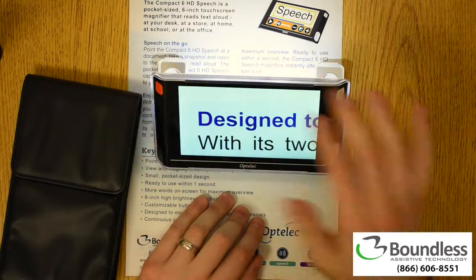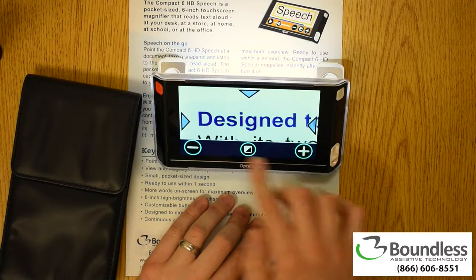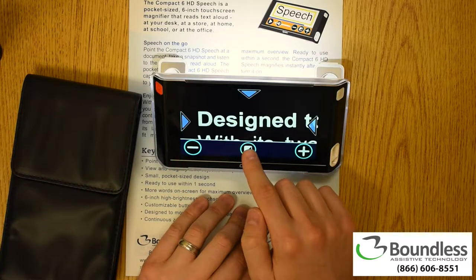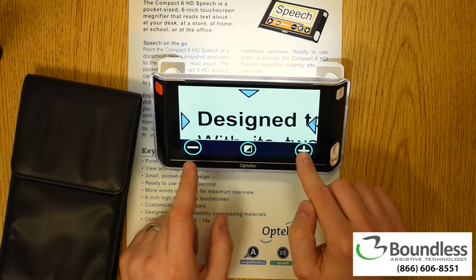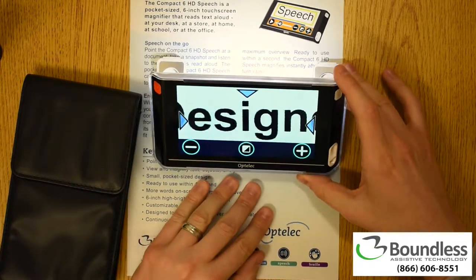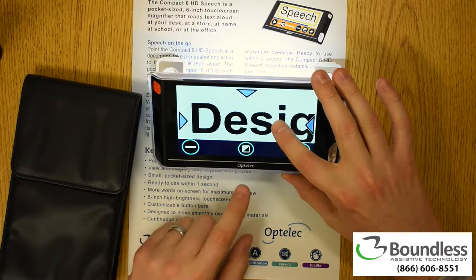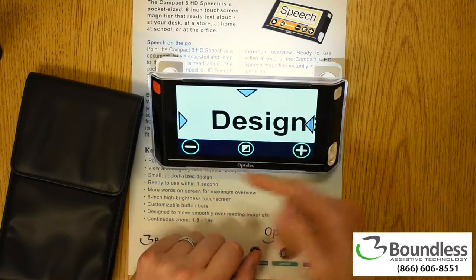Right now I'm looking at this text in full color, but watch what happens as soon as I touch the touchscreen. I have some buttons I can press, and I can make those letters really pop with enhanced color contrasts. I also have some virtual buttons here that I can press to have things get magnified, and once I'm done I can get rid of this just by tapping on the screen, or I can make it smaller with the minus button.